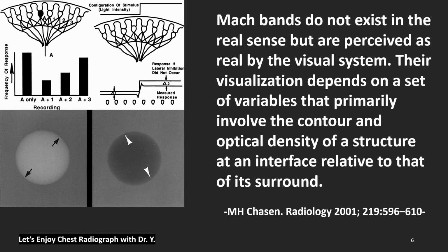With nice illustrations and nice experiments, it states that Mach bands do not exist in the real sense, but are perceived as real by the visual system. Their visualization depends on a set of variables that primarily involve the contour and optical density of a structure at an interface relative to that of its surround. M.H. Chasen, Radiology, year 2001.